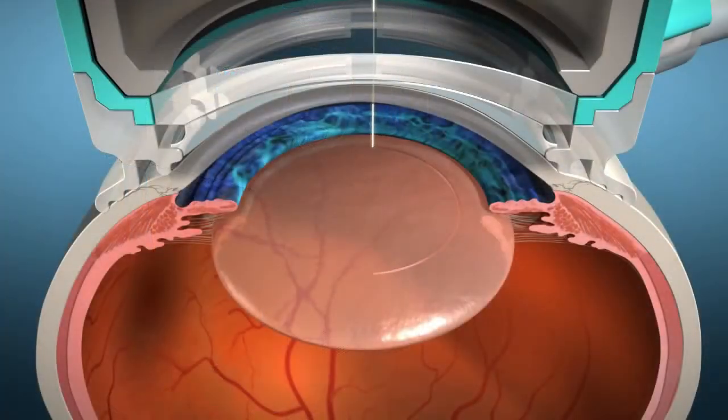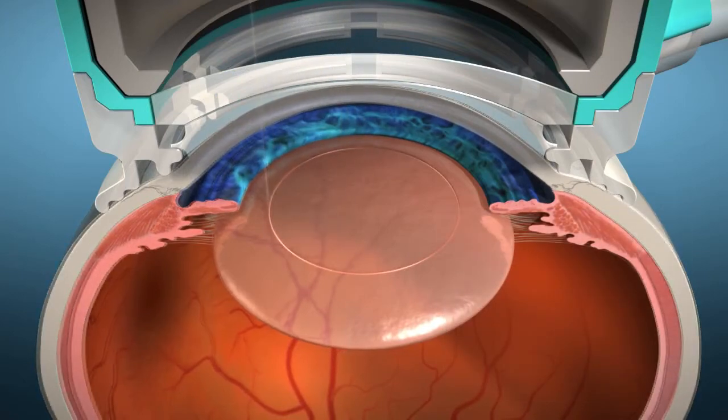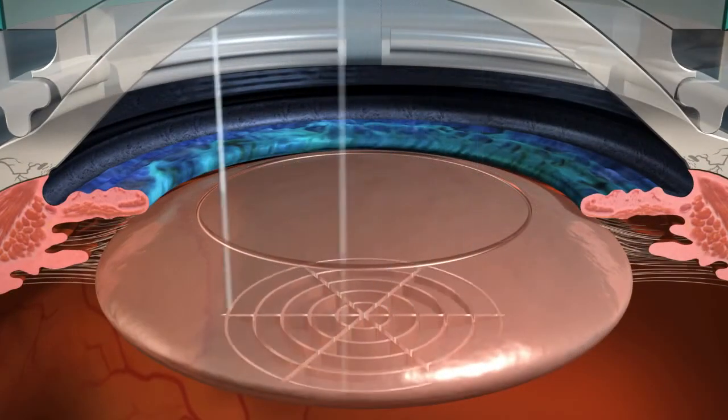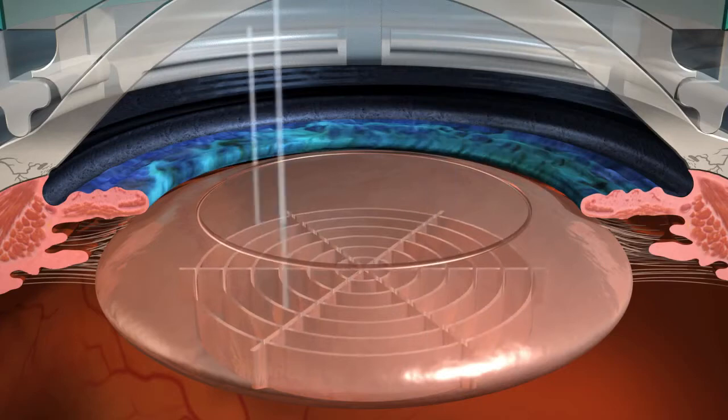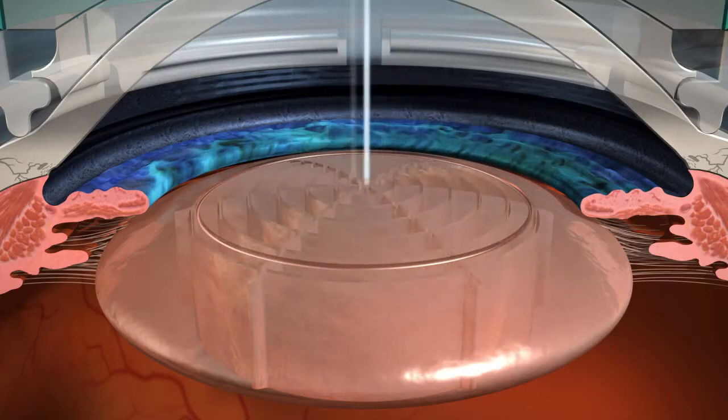Once the laser is engaged, an image-guided, precisely-centered capsulotomy is performed. Next, the lens treatment is started to prepare the lens for efficient removal with reduced phaco power. The treatment starts from the posterior side of the lens, moving towards the anterior surface.